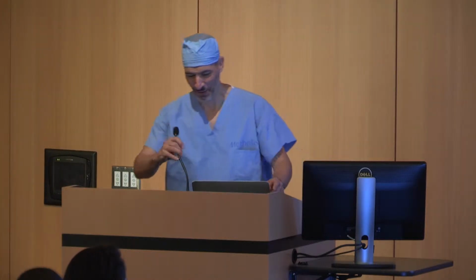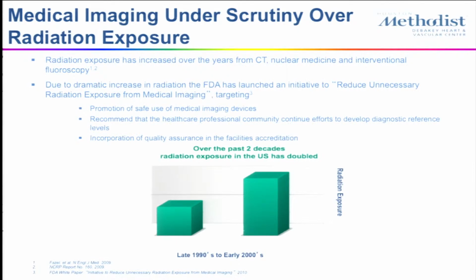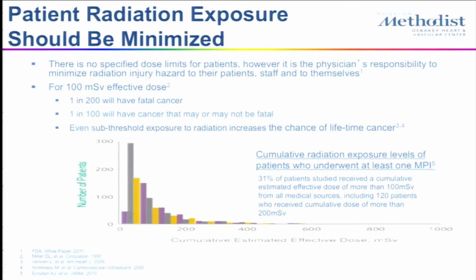Thank you. So I'm going to briefly give you an introduction as to why we're doing this. In EP, we have probably the greatest exposure to radiation, more than anyone, because we do implants of pacemakers with the image intensifier right next to our face. And then we have some procedures that require complex navigation in the three-dimensional structure of the left atrium and the left ventricle that used to have fluoro times of 90 minutes and more sometimes. So we obviously want to reduce radiation exposure, which is not just limited to interventions, but also diagnostics as well.